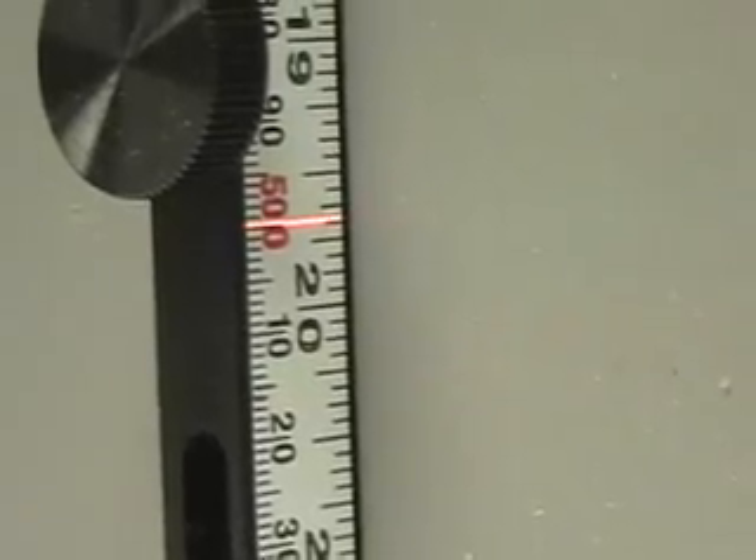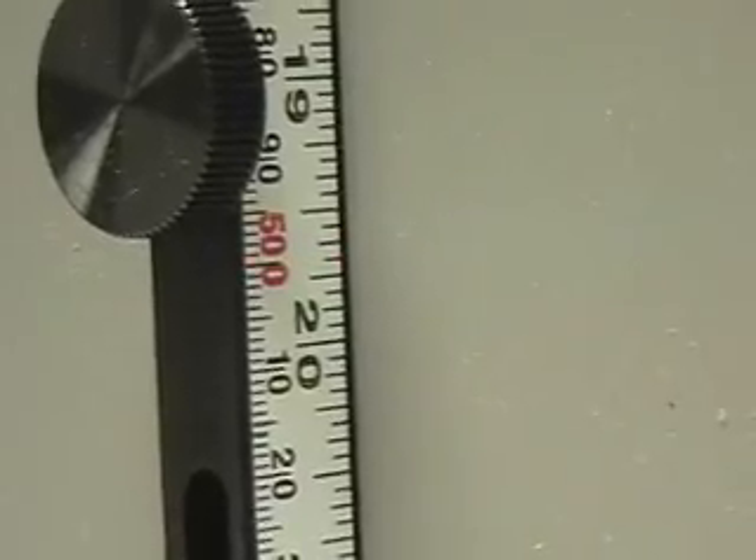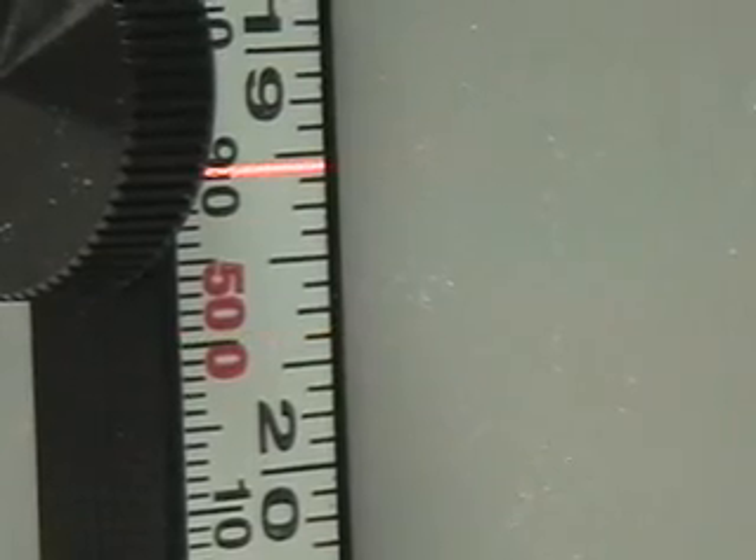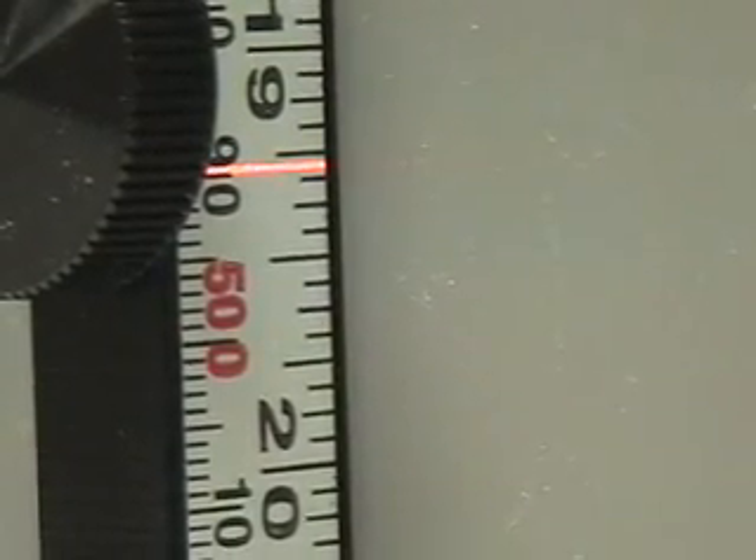Once we did the negatives, now we're back at zero. Now we're going to do the positive end — centimeters. So we're going to hit the up arrow and it's going to go to 90. There's the 90. We'll go one centimeter up, and it's there. That's good.